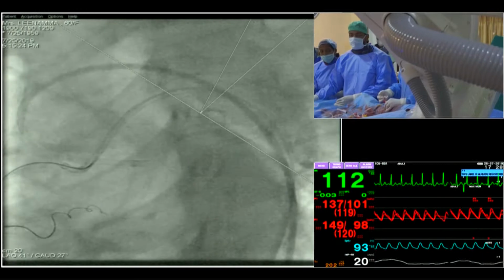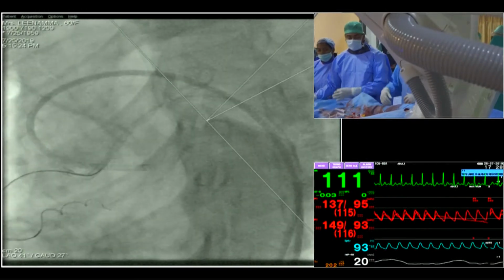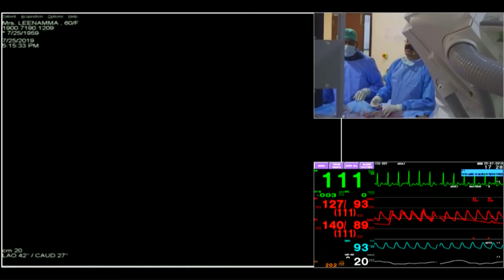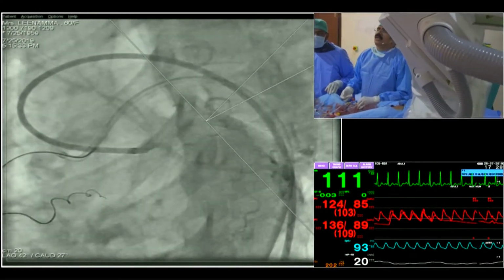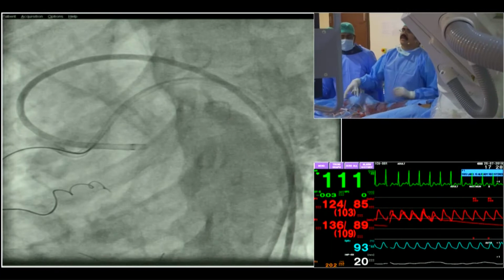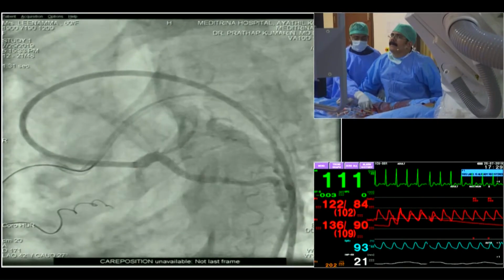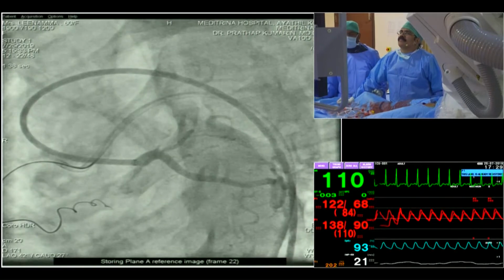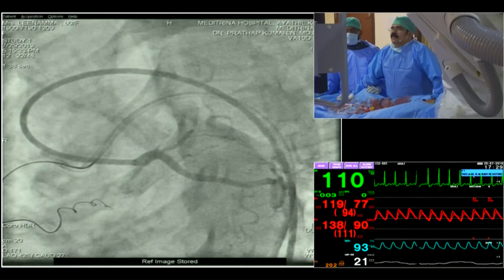If you see a small track positively, I think that helps us. Basically, towards the edge, you see, this is an ostial stump. You can't see that very well. You can see an entry point there potentially, a small tab, yeah, an entry point. There's a peak there.